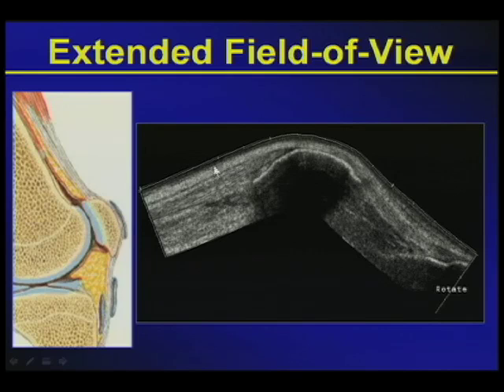Behind the suprapatellar region, you'll notice the triangular suprapatellar fat pad separated from the prefemoral fat pad by a small amount of fluid, physiological fluid, in the suprapatellar recess, much like what we see in Dr. Netter's drawing, from the suprapatellar fat pad to the prefemoral fat pad to a tad bit of fluid in the suprapatellar recess. Below the patella, right behind the patellar tendon, you have Hoffa's fat pad, again showing the complete resolution that we can appreciate between Dr. Netter's drawing and our grayscale imaging.